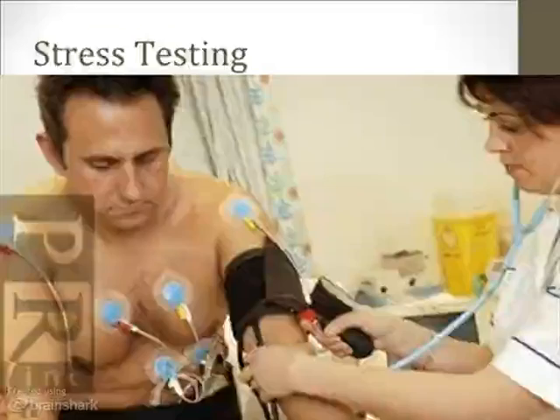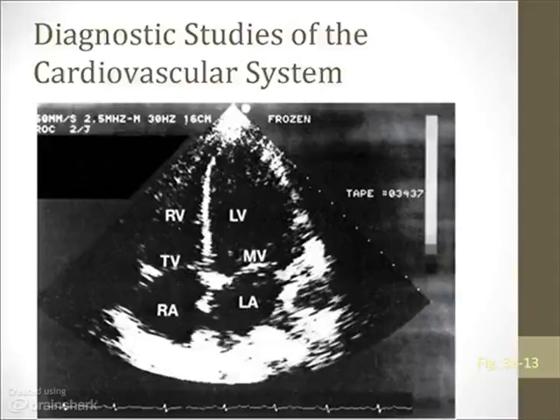The echocardiogram is yet another non-invasive diagnostic procedure that is done to evaluate for both structural and functional changes within the heart. This ultrasound uses high-frequency sound waves to assist in diagnosing many cardiovascular disorders.